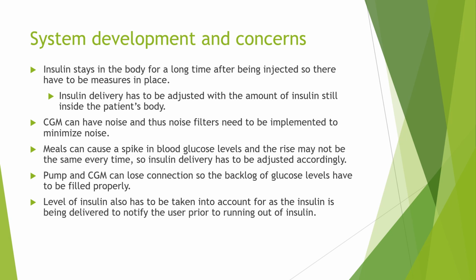Another thing is that insulin stays in the body for a long time, and it doesn't simply dissolve away. So we also have to take into account how much insulin is in the patient's body before we inject, and while the insulin is being injected. So there should be a control mechanism, a safety mechanism for that. And the other concerns are listed.